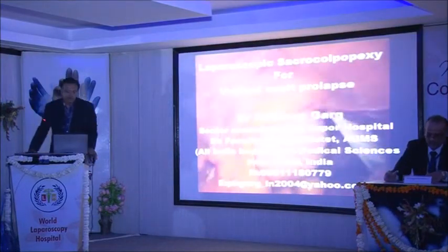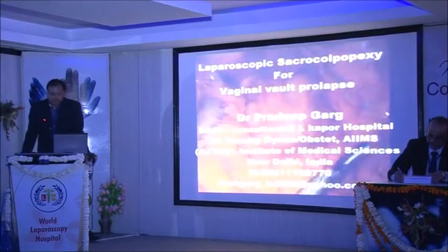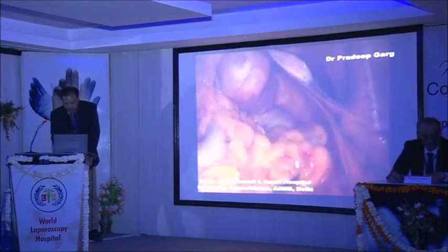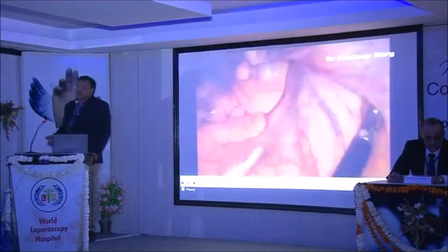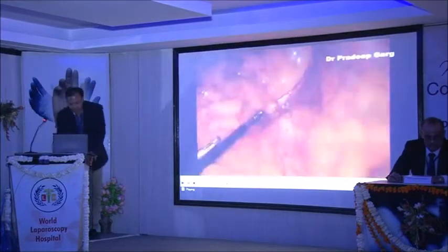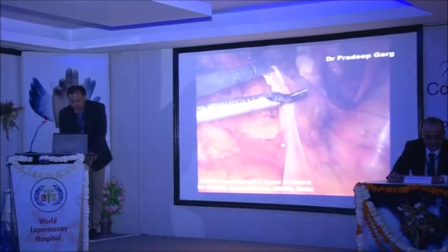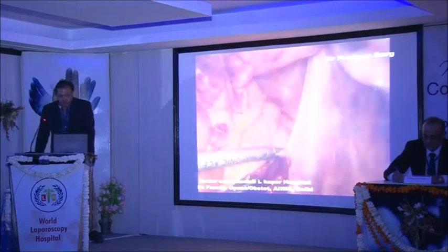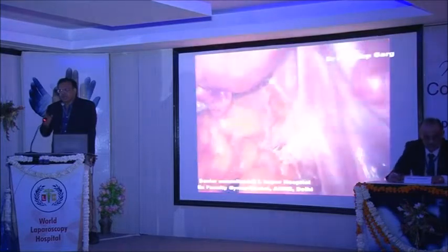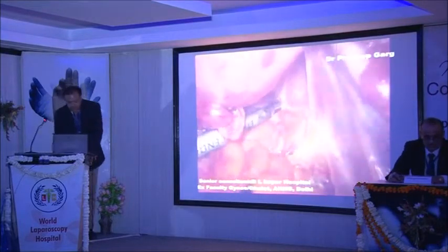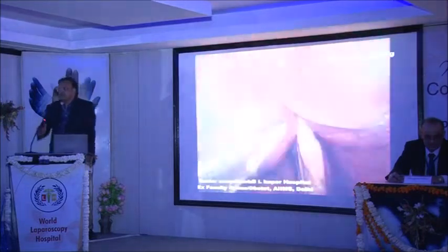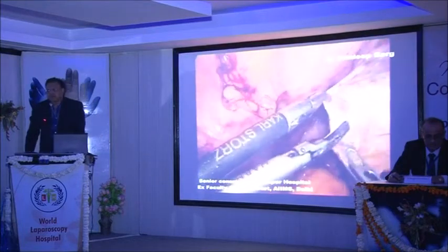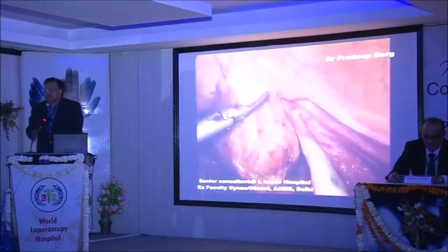This is a patient post-hysterectomy who came with prolapse of vault. Here you can see the bowel is in the way. You have to dissect — obviously since this is a post-op case, you will expect some adhesions. After clearing the adhesions, you have to dissect from the sacral promontory. You pick up the peritoneum, cut over the peritoneum, then the sacral promontory will be exposed. Remember, you have to work over the right half of the sacral promontory, and you have to keep on dissecting till the right utero-sacral ligament, medial to the right ureter. These are the only two silent features to keep in mind: right half of the sacral promontory, medial to the right ureter. You have to cut the peritoneum.